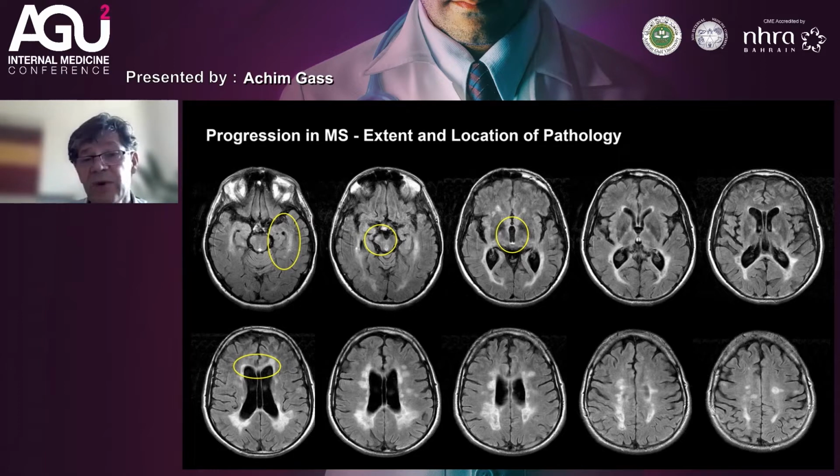This is a patient who had an EDSS of 2.5, which is not such a severe clinical situation at the time when you had the scan, but you can see there are many very abnormal features. For example, the third ventricle is too big. You can see the pyramidal tract is involved, both temporal lobes and hippocampi are involved, as well as the corpus callosum is too thin, so you have features of many lesions, as well as brain atrophy. But at the time, this patient was still coping pretty well, because most of his lesions were supratentorial.